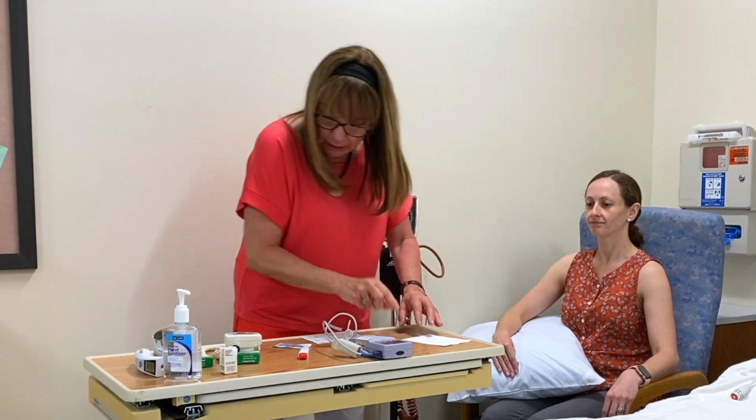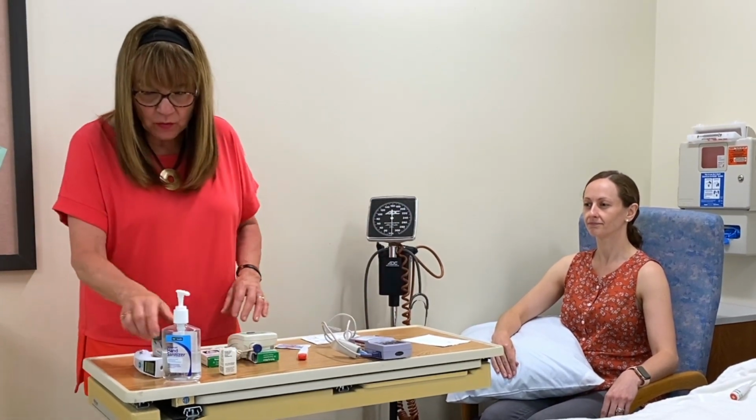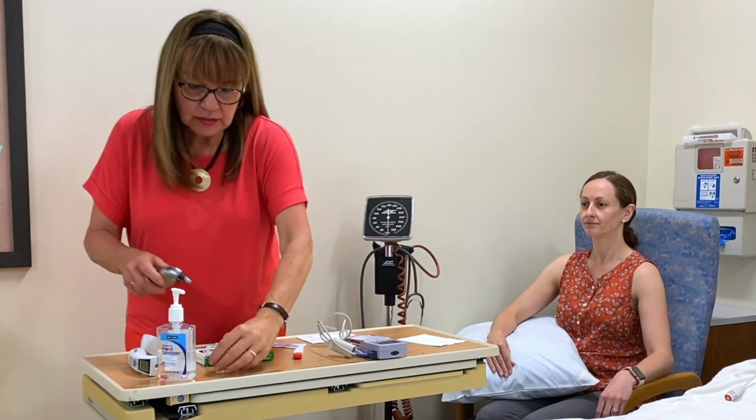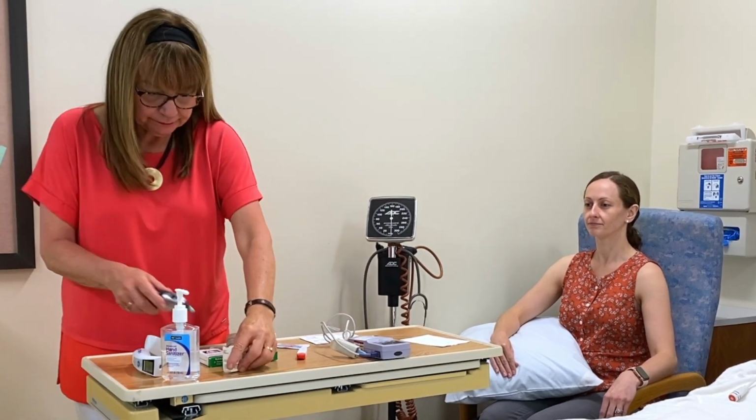Now I'm going to take Monique's temperature another way. I'm going to take it tympanically in the ear. The tympanic membrane shares the blood flow with the hypothalamus. It's a pretty accurate measure.